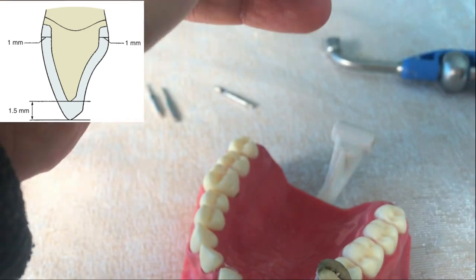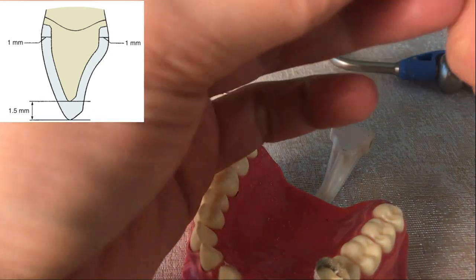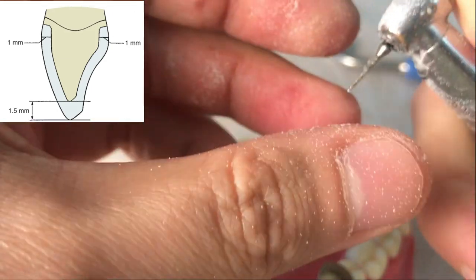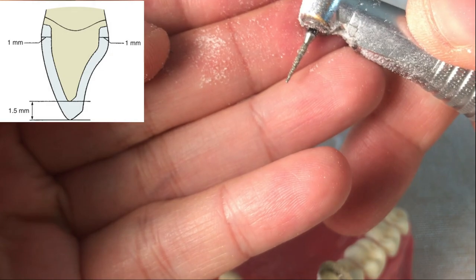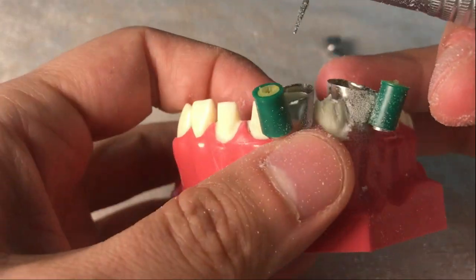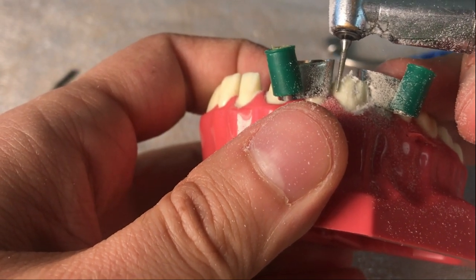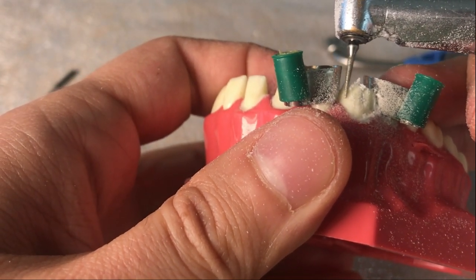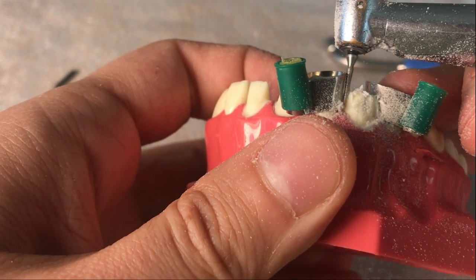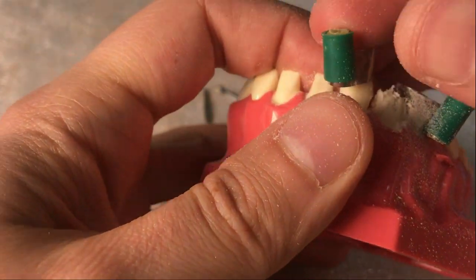Later on, as you can see in the video, I insert the flame end burr for the removal of the axial walls. While removing this area, I move the burr slowly back from the buccal to the palatinal. Even if the matrix band is placed, if you move the burr uncontrolled, you may damage the adjacent tooth.